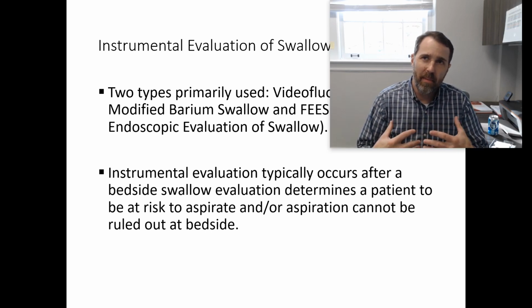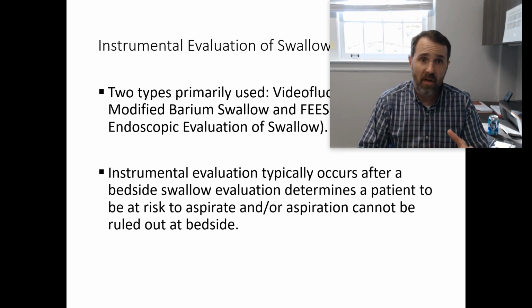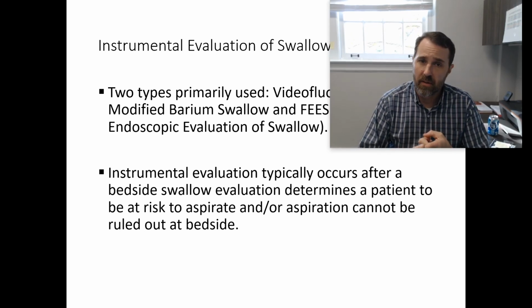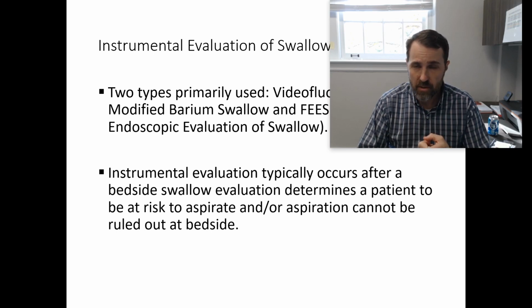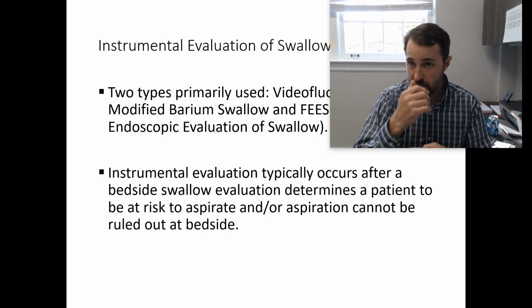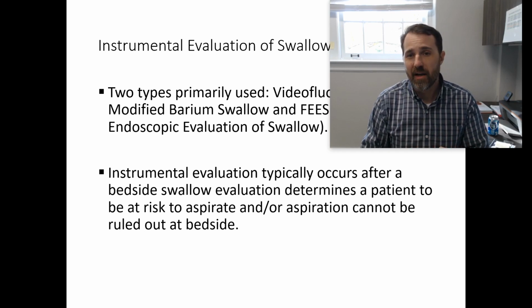And the two primary forms of instrumental assessment of the swallow that we use are the modified barium swallow, also called video fluoroscopic swallow study, VFSS, or fibroendoscopic evaluation of swallow, which is FEES.